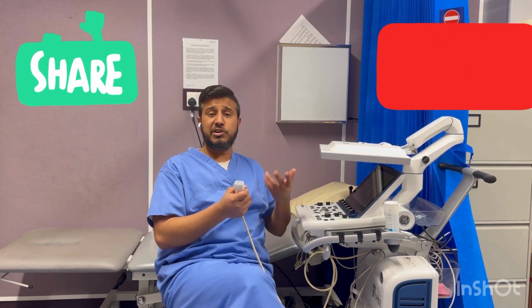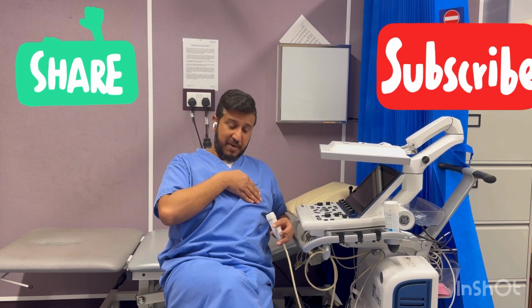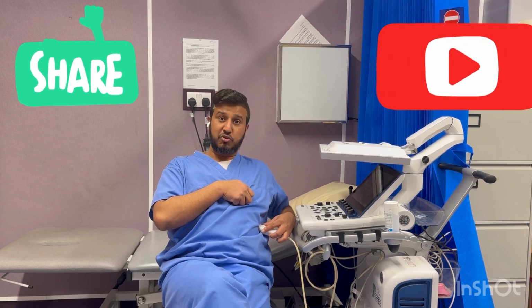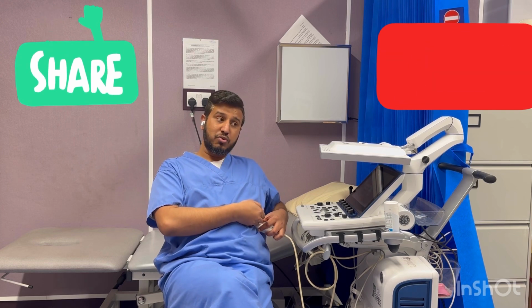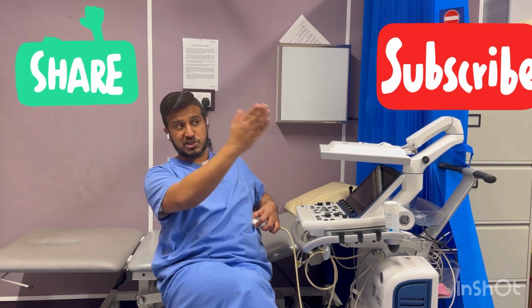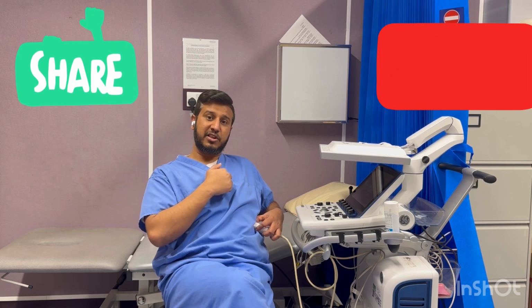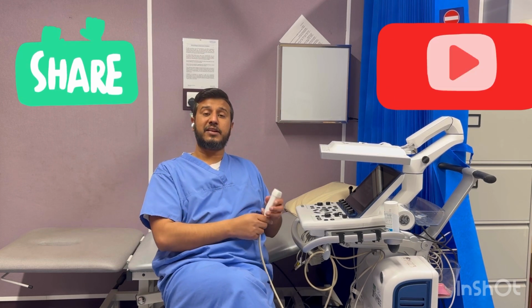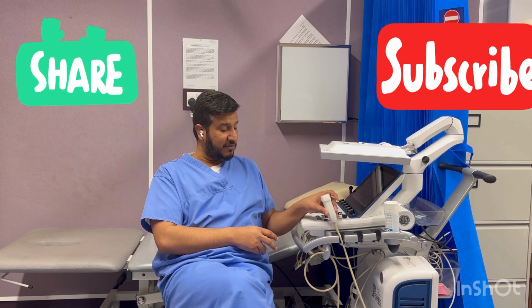The trick I usually used when I was learning is that my parasternal images are here, so my apical views should be here. So I try to keep the angle of my probe towards my long axis image, where I get the long axis image. If you keep that angle, you will automatically get good images of the apical views.